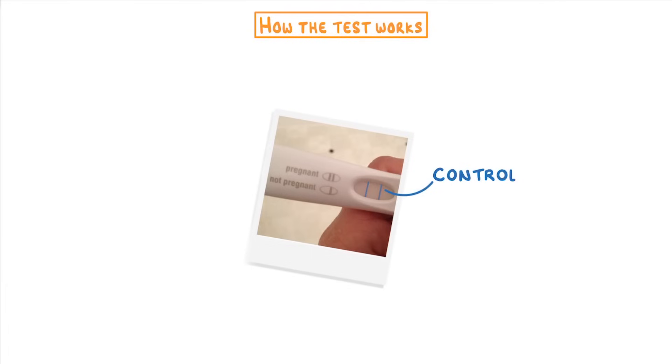Also, we just want to point out that most pregnancy tests in real life actually have two lines rather than one, with the second line acting as a control. So you normally need two lines for a positive result. Just remember that different tests do work differently though, so just be sure to read the instructions before you use any.